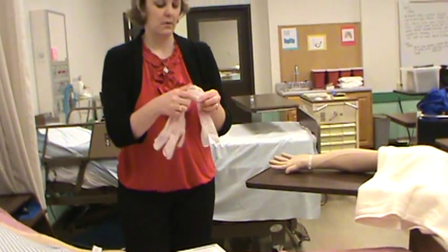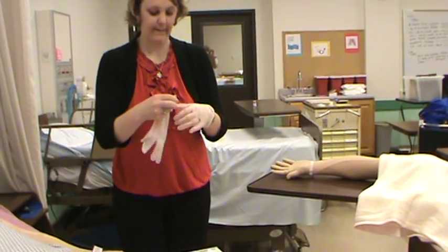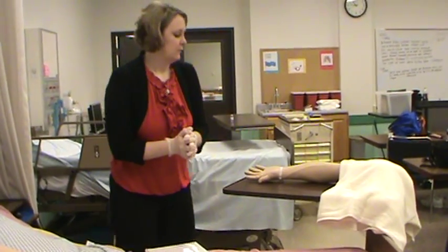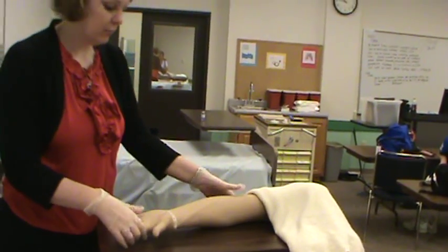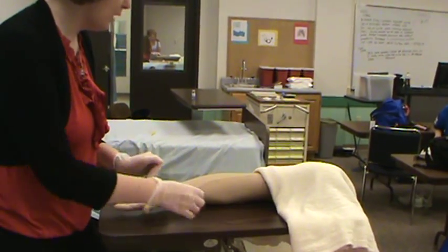Apply disposable gloves. I'm going to go ahead and put my gloves on. Locate the area on the inner aspect of the forearm. Avoid any visible blood vessels. For testing, you're going to use the IV arm to test out. So again, I'm going to locate the inner aspect of the arm.